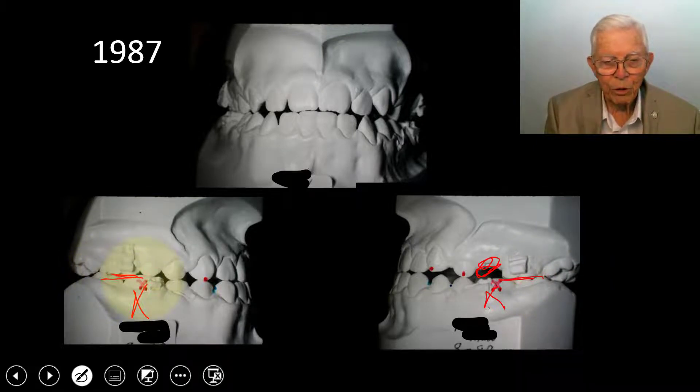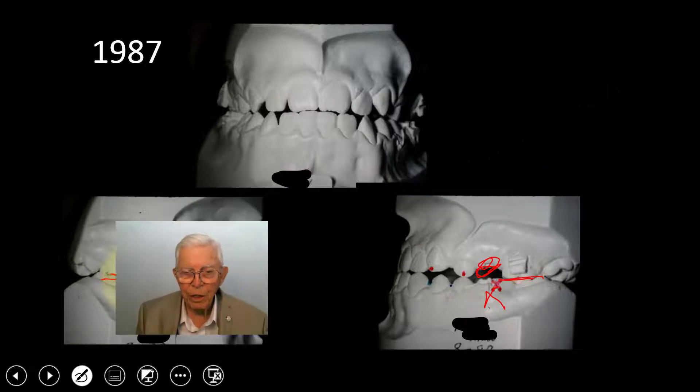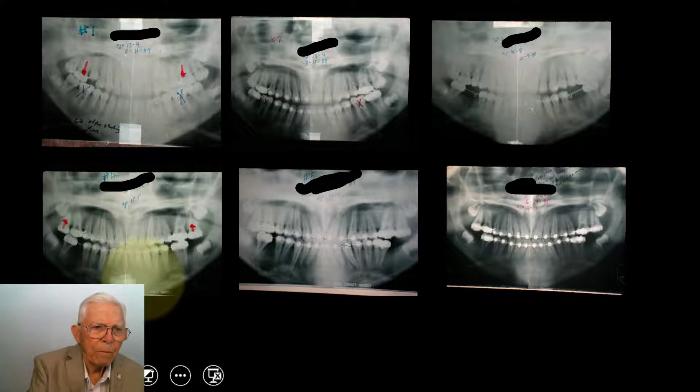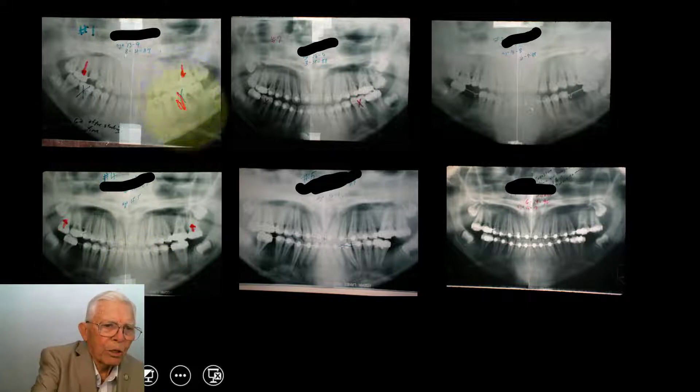I've got the x-rays lined up so you can watch these teeth move, and we'll show you that each time. The full x-rays — this is number one, started back in 1987. We took these six-year molars out, and we make sure you've got the wisdom teeth, which are back down there and growing.